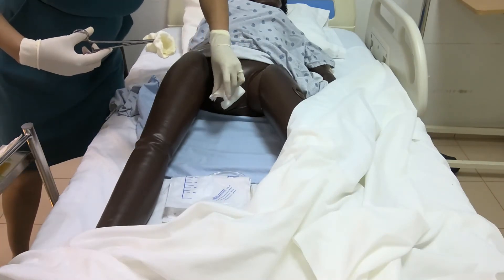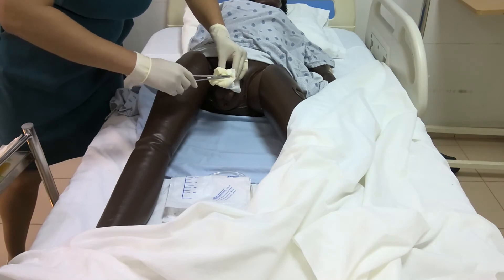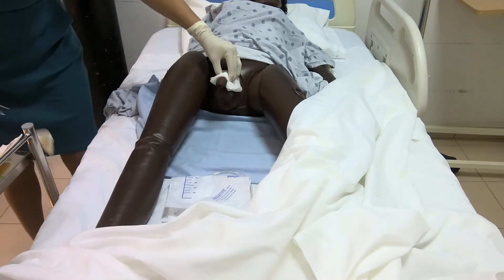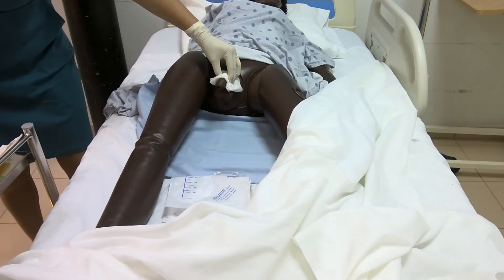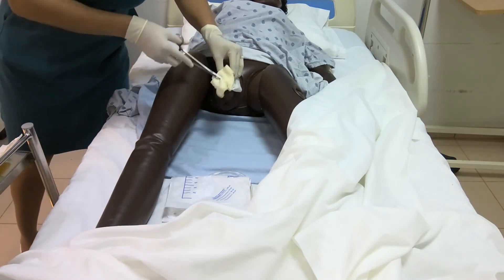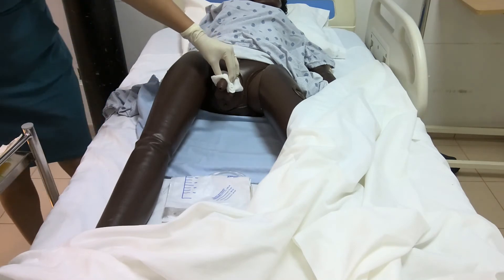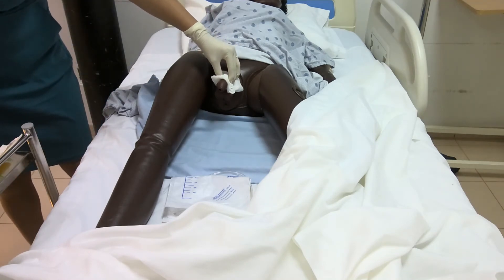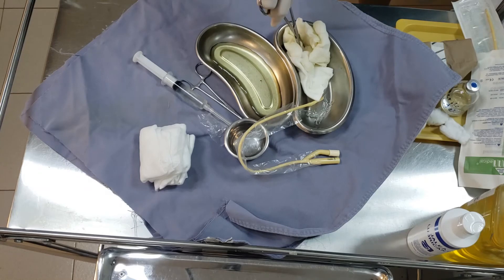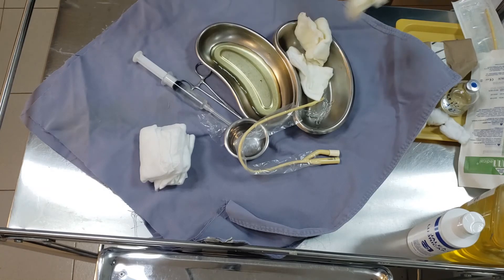For men, use your non-dominant hand and grasp the penis just below the glans, and if necessary, retract the foreskin. Hold the penis firmly upright with slight tension to help straighten the urethra. Wipe the meatus using a forcep to avoid contamination of your sterile hand needed for passing the catheter.